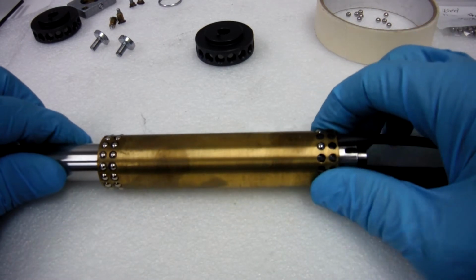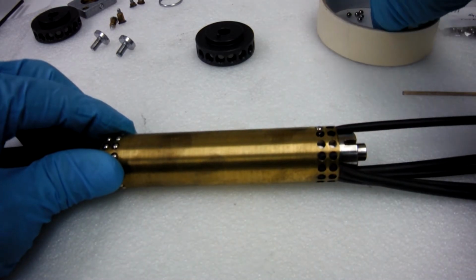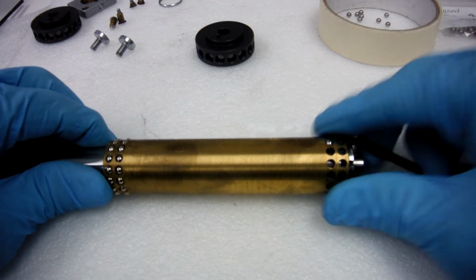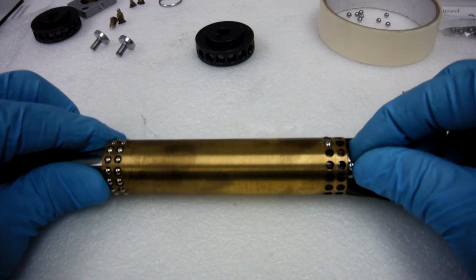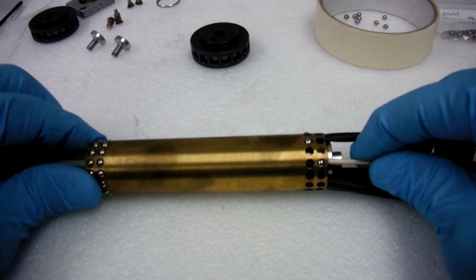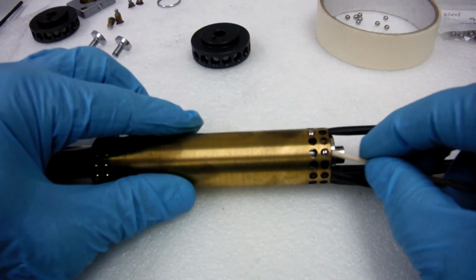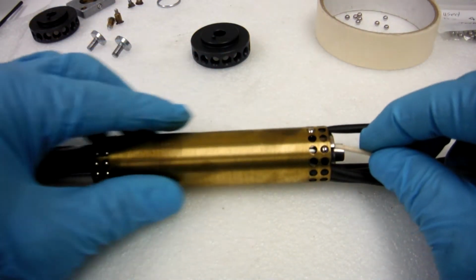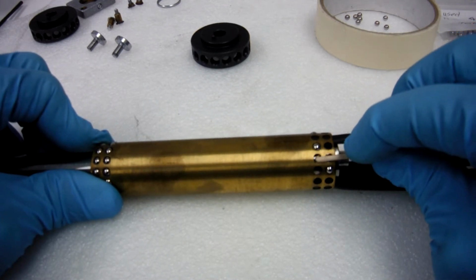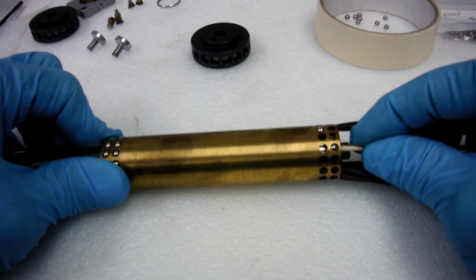Push the axle so you don't lose it. Turn it. Skip one. Line it up. See, I'm pushing the bearing track past just enough so that my bearing can get closer to the hole while I'm pushing at the same time. I don't want to push too far because I'll lose these bearings back here. Just pushing it just enough for that next row to clear.